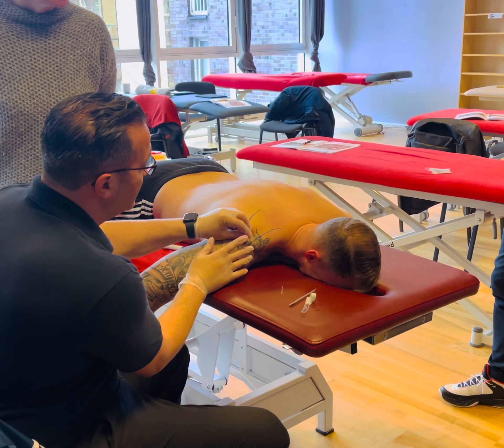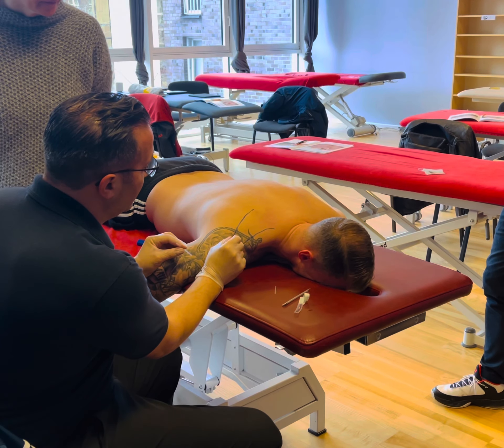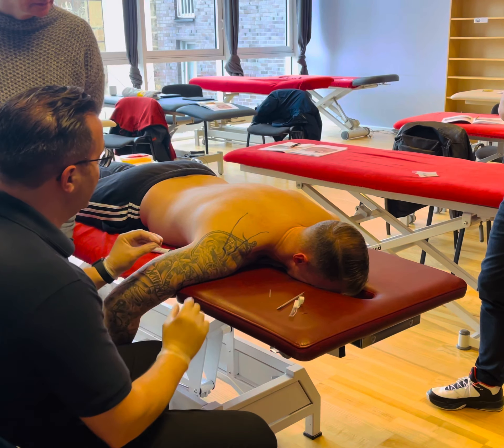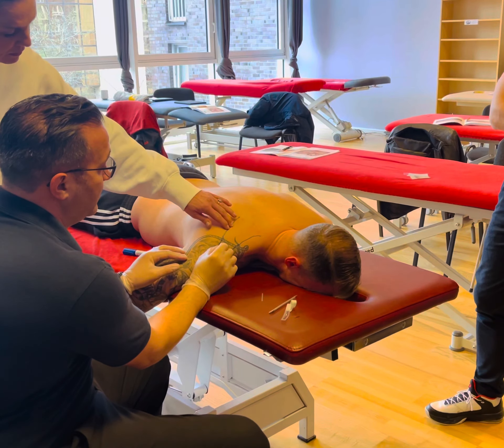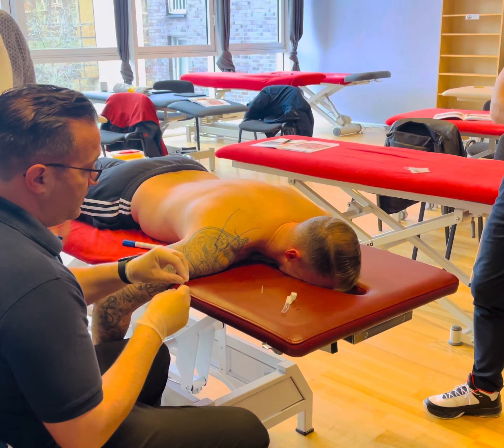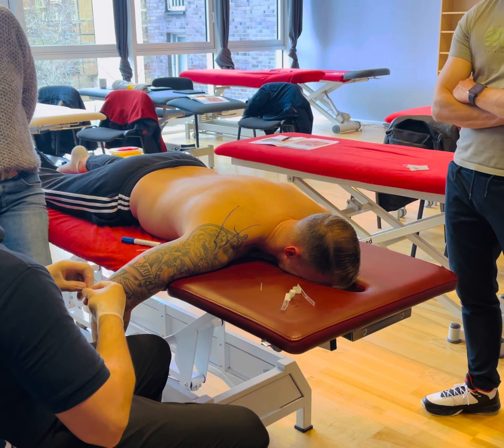50 degrees to the skin approximately, in, and then we can thread through. Now, am I certain that I've actually got through trapezius? No. Do you concur, doctor? Yes.